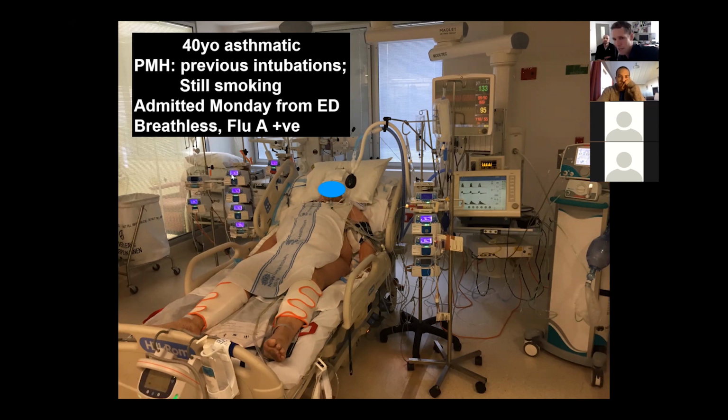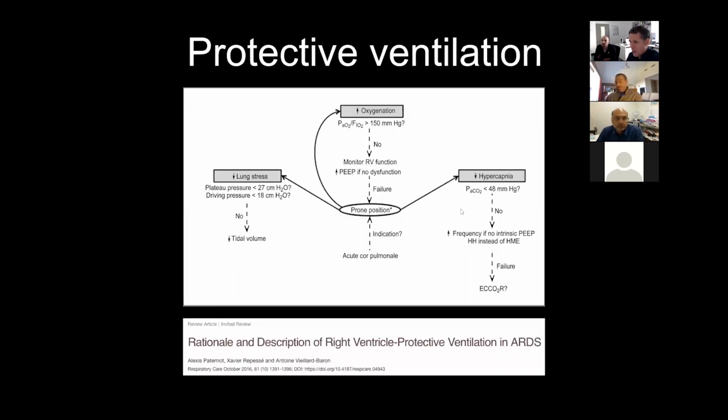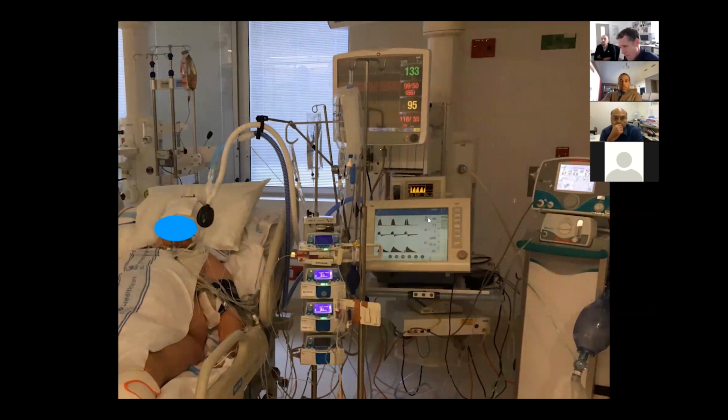So Sid, I've got a 40-year-old asthmatic who's been intubated many times before. They're from Penrith, so they don't want to stop smoking. And even despite being intubated several times, comes into ED on a Monday, breathless, flu A positive, gets intubated. We've got them on an anaconda circuit. You can see here that they've got very high peak pressures, but the plateau pressures are still less than 30, but they're being ventilated pretty hard.